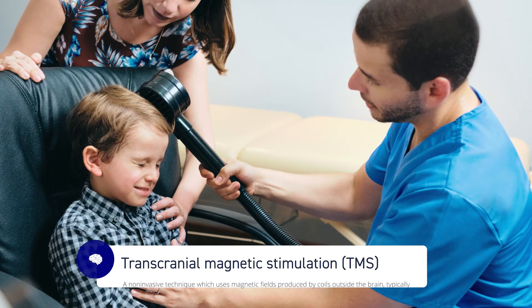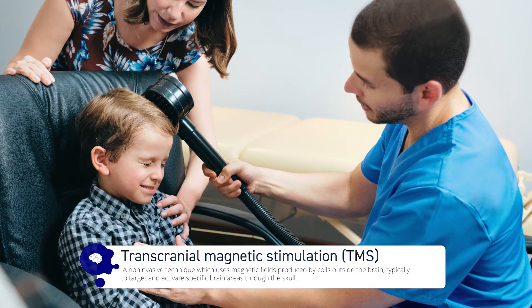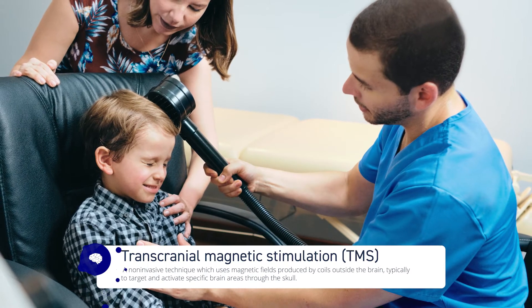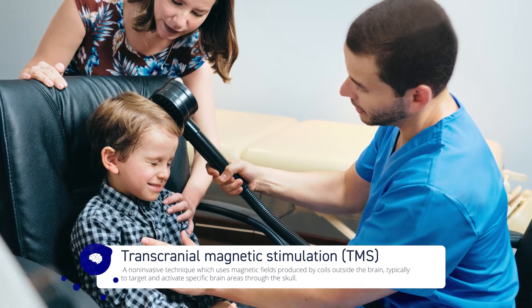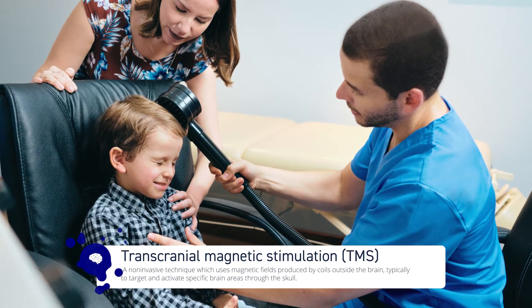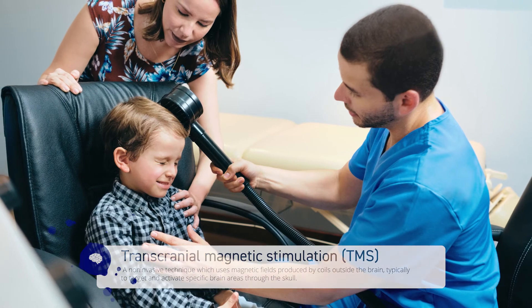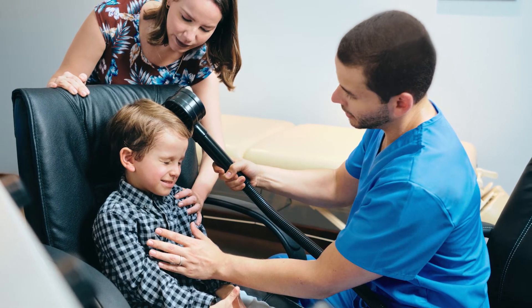Transcranial magnetic stimulation, or TMS, is a non-invasive brain stimulation technique that uses electromagnetic fields to generate action potentials. Many forms of TMS have been developed. Some treatments require the patient to make frequent visits to the doctor, which decrease over time, while others offer in-home solutions. The frequency, strength of stimulation, duration, and coil design can all be tweaked to change the effect of TMS based on the objective.